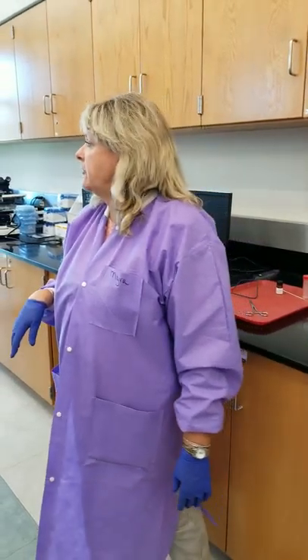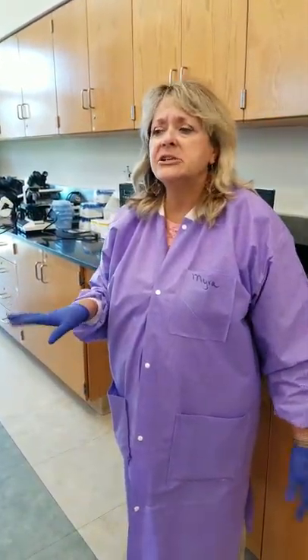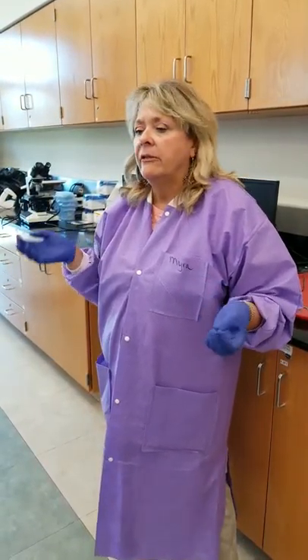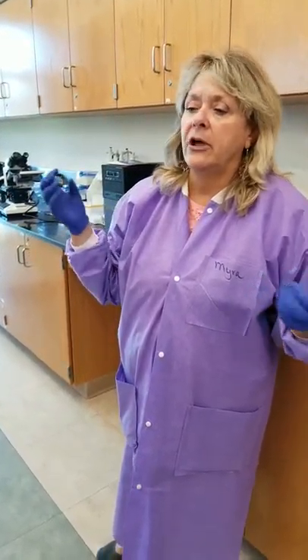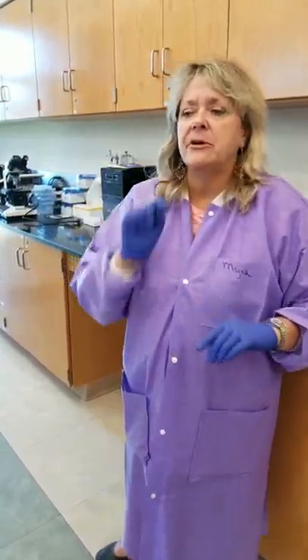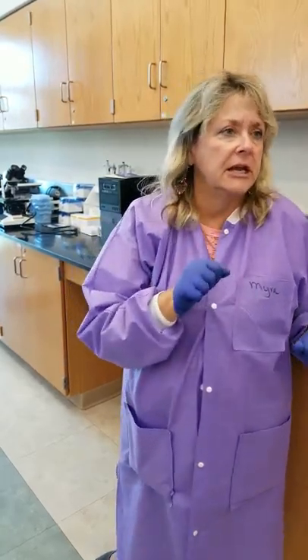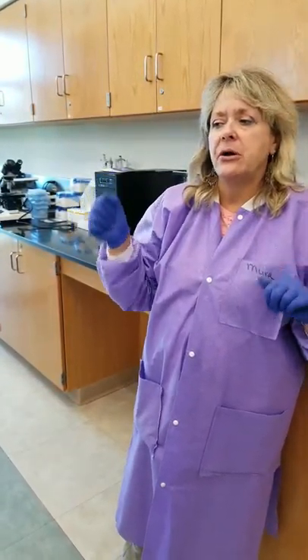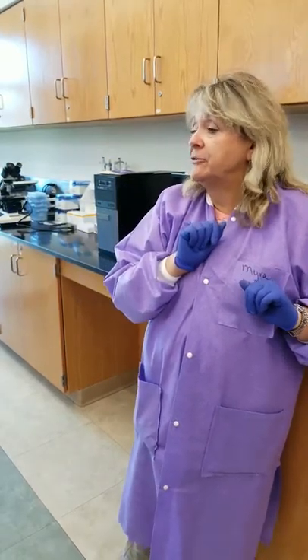Timing is not terribly critical. You want the cards to incubate for at least 15 minutes. They can go probably to 35. And like I said, it's not so much because of the time, but because of the warmth and the volume that you've got in your gel cards, that you can have evaporation, and then you can have false negatives or false positives because you've got crusty polyacrylamide gel. So if you leave that in once the timer goes off, you don't have to jump over there and immediately stick it in. It's not like it's going to blow up and have smoke everywhere. Once that happens, I'll walk around and show everybody what it looks like, and I will move that so you don't have to look at it.